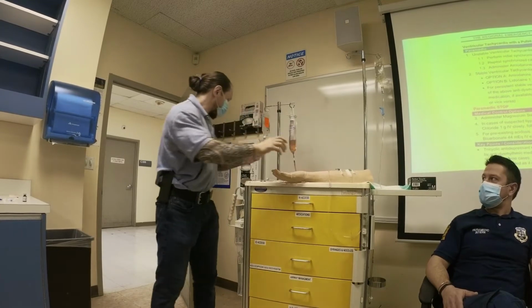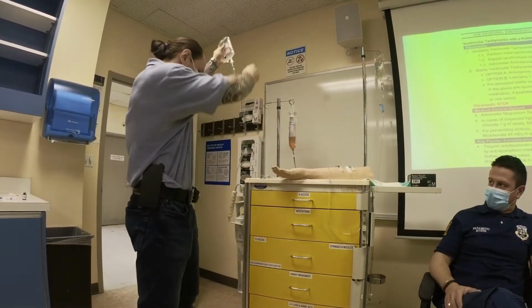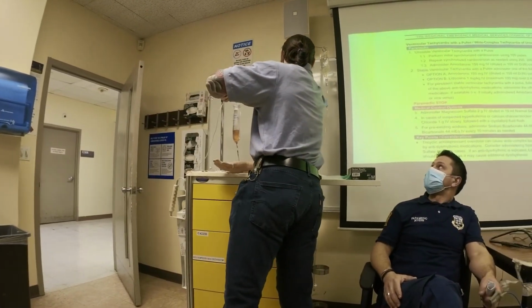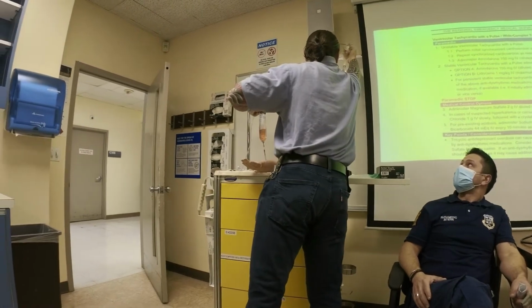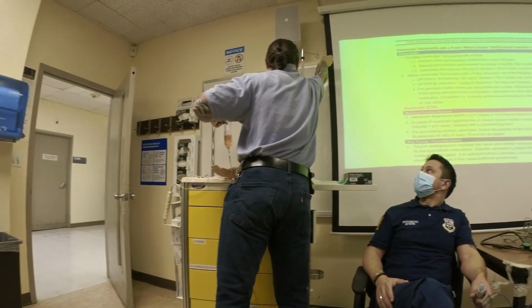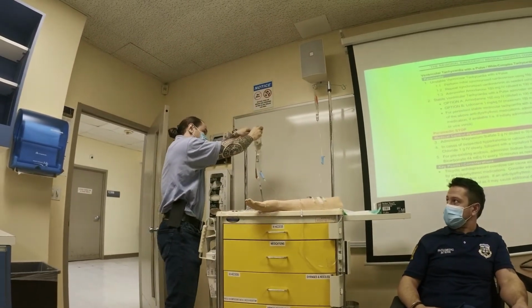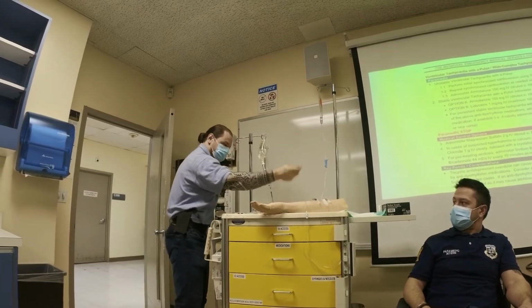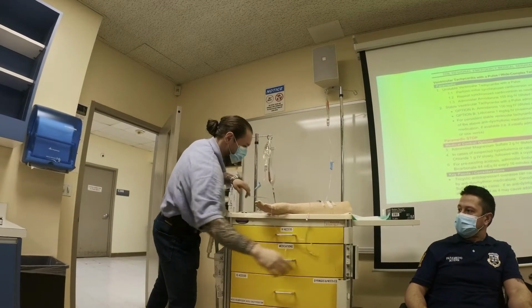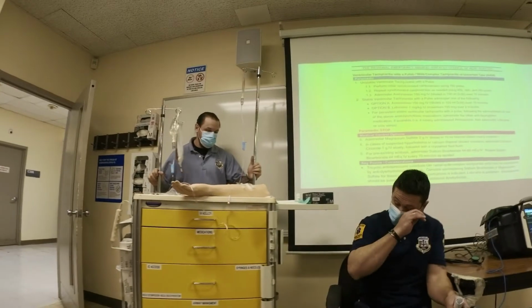So I cleaned it. What else? Close the main, and put that up higher than the main. Exactly, right? So this one goes here. This one goes lower. If you have the administration set from the piggyback, it's going to have those specific connections. Everybody see that? So now I'm going to come over here. I'll show you a little trick that you want to do, right?